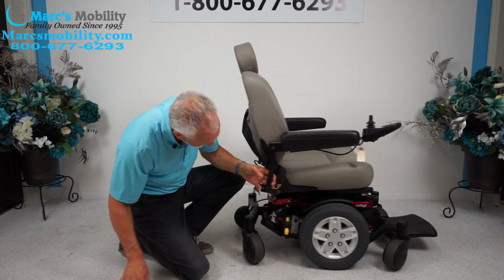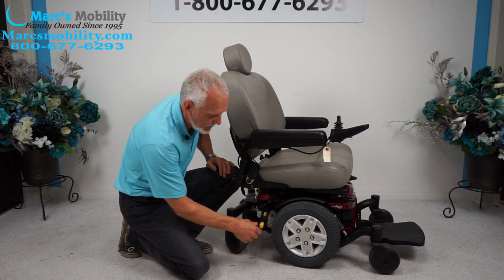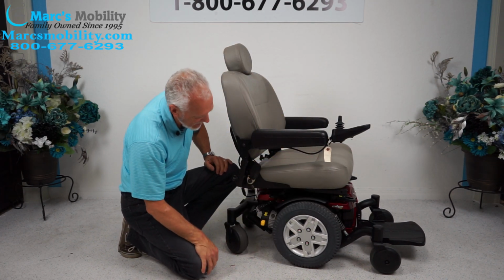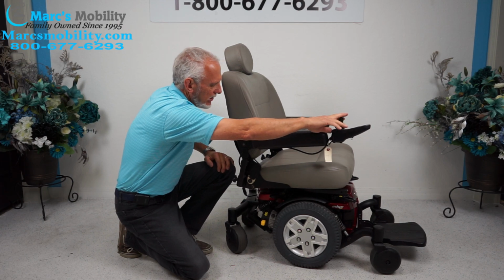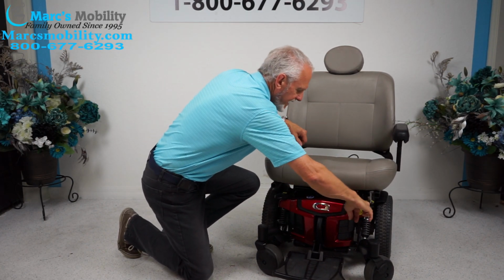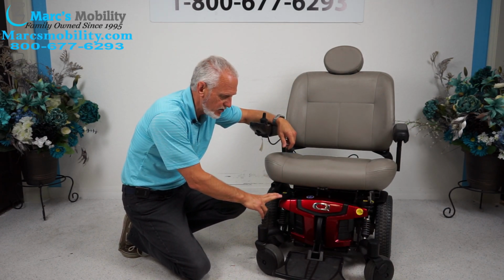Now, also this chair has an anchor point right here. I'm going to put the motor back in gear so we don't forget it. We're going to turn the power back on. And the reason you want the power off is you want no resistance when you roll it. There's an anchor point here, and you can see the front one a little bit better if I turn the chair. You can see the anchor point here and the anchor point. This is where you would secure your chair to your lift or to your van for transportation.